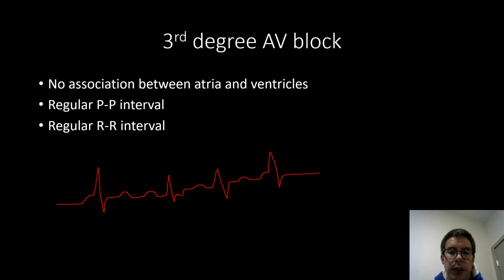For this, if we were to draw the P waves in, it'd be there. And there's one after that, one there. And there's one there, it's just farther down. And there, then there would be one, according to the interval, there would be one in here, but it's drowned out in the QRS, so you can't see it. There's one there, and then there would actually be one there probably.